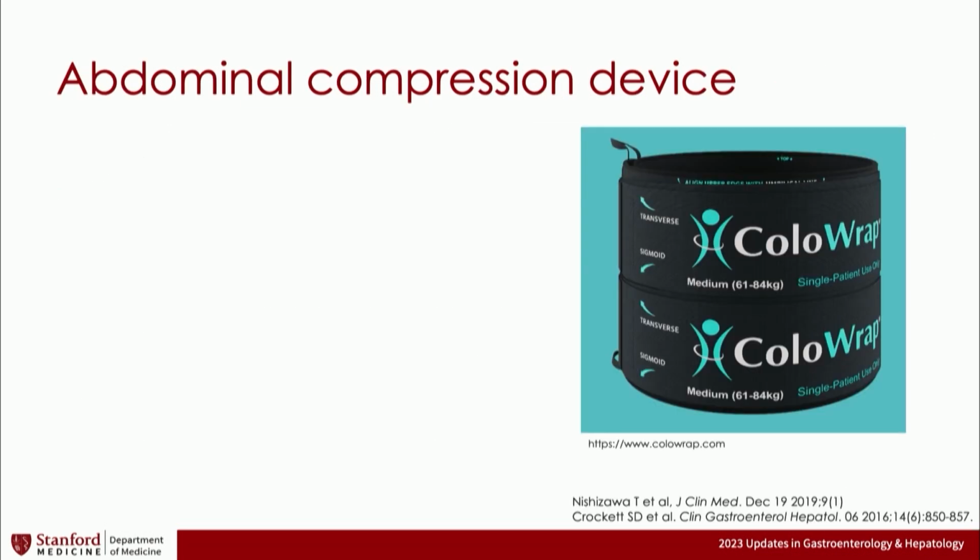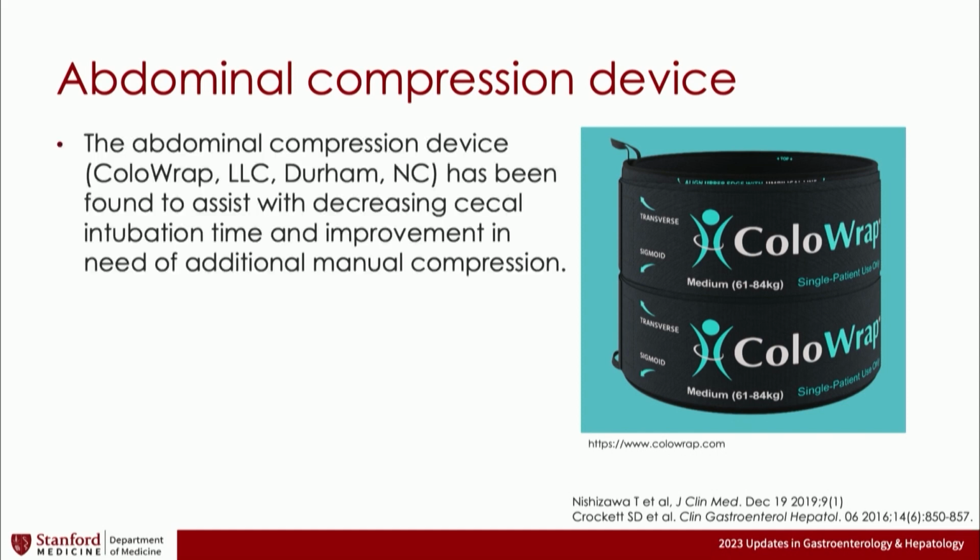Given the importance of abdominal compression, and unfortunately the huge burden on our staff, we think about abdominal compression devices to try to help. This is the ColoWrap device, which has been found to assist with decreasing cecal intubation time and improve the need for additional manual compression. Similarly, this product has not been specifically studied in the context of incomplete colonoscopy.